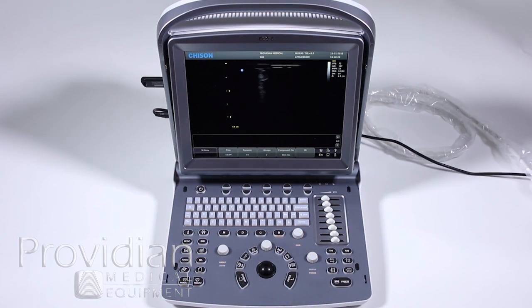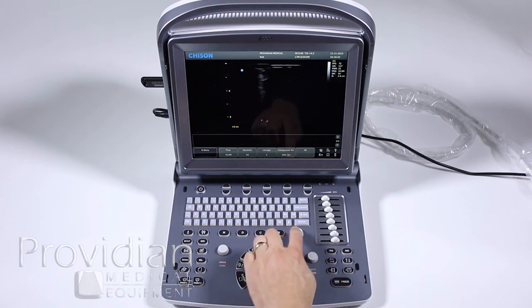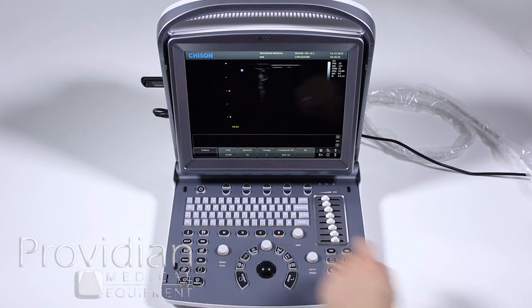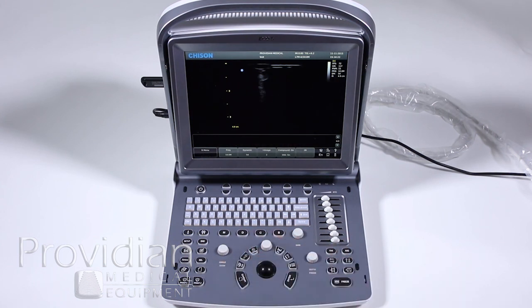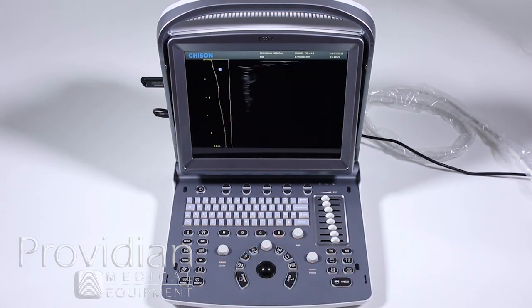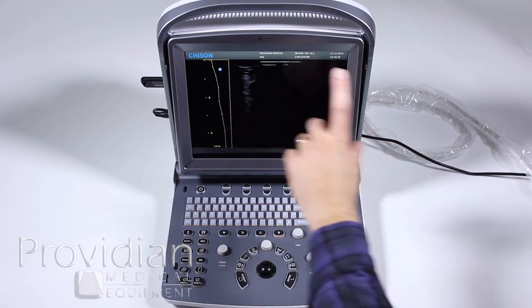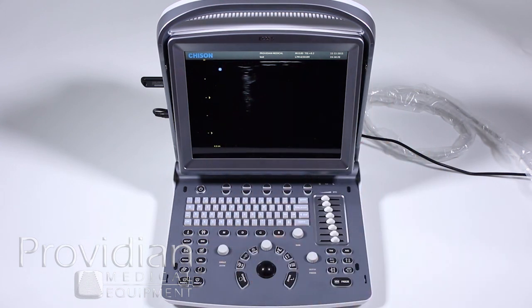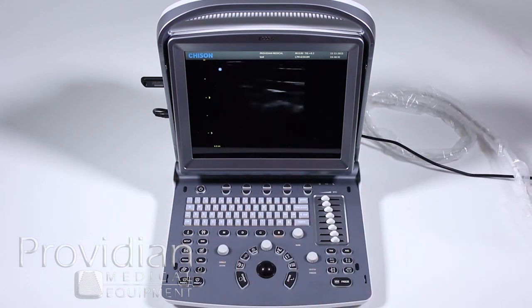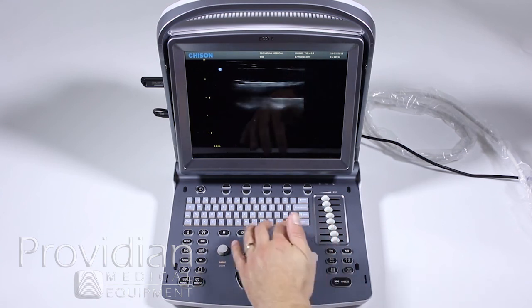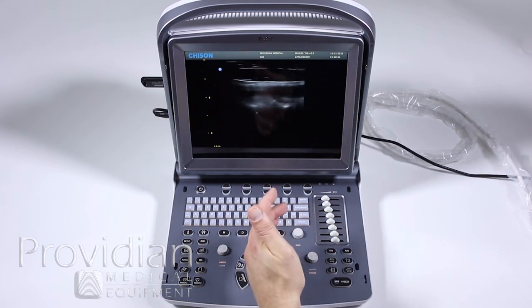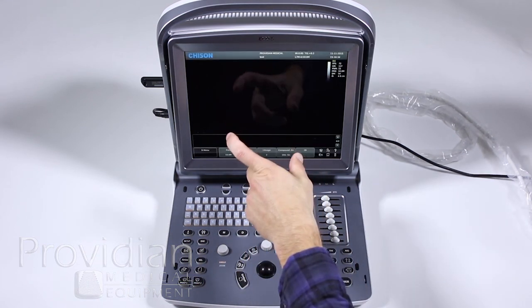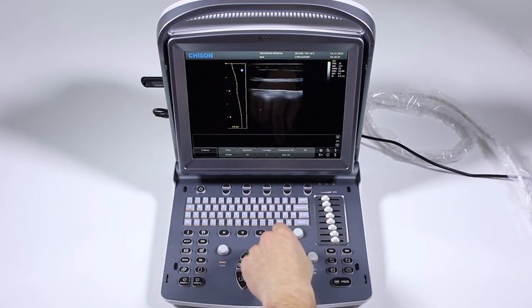One other note in 2D: there's a hidden feature. If you push the gain button down, it goes to full screen — you lose the information around the sides and the image increases to fill the full screen. Hit gain again to return to the smaller image.